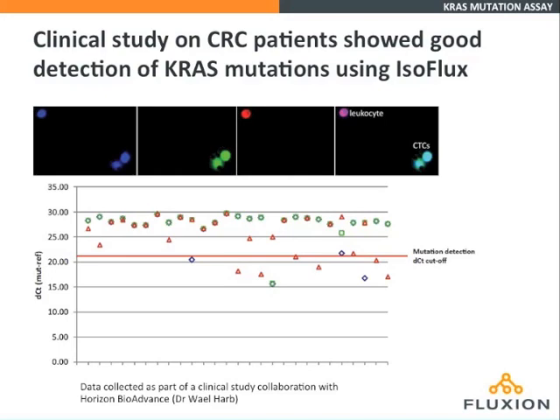Now, many of these mutations were the same as the primary tumor mutation, so we had primary tumor status as well for these patients, but some of them also changed their mutational status. So in the time from the initial biopsy to the CTC draw, which was 2 months to 2 years, we found that, again, a significant fraction of patients had acquired mutations.